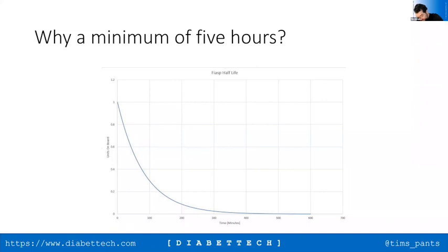Now, one thing I would be very, very careful about here, and this is something that's going to cause problems when you talk about this with people, is the Medtronic models in the 670, 770, and 780, because they use a term they call, I think it's IAT or AIT, insulin action time, and that number in the 780G is 2 hours, or in some cases, you get better results with 1 hour. It bears absolutely no reflection to the physiological testing that's been done in relation to the time it takes insulin to get in and out of the body.